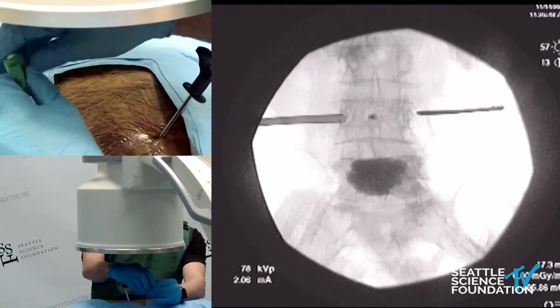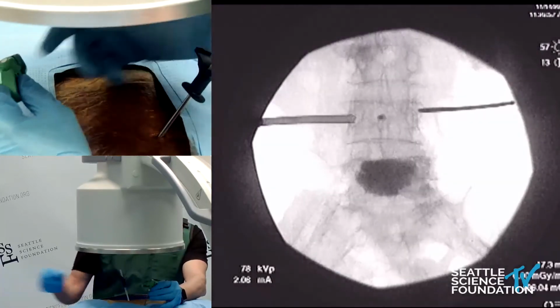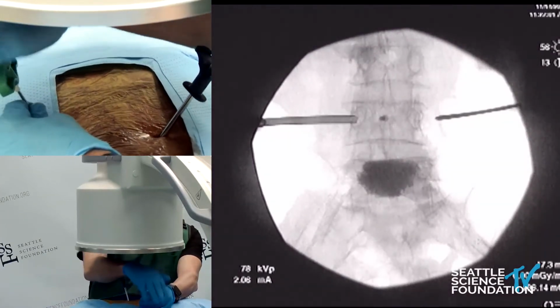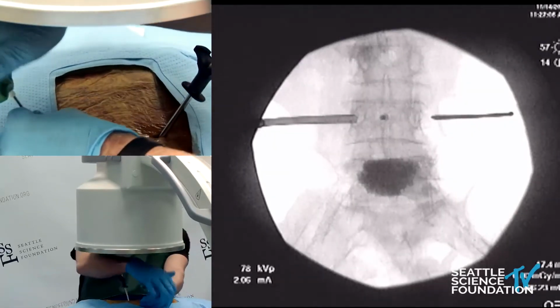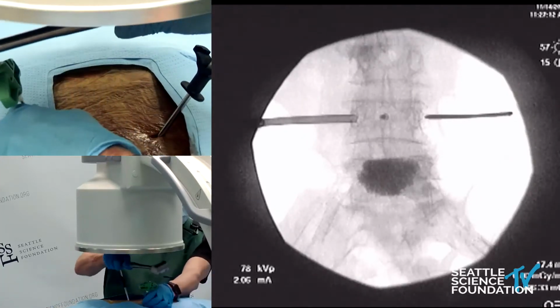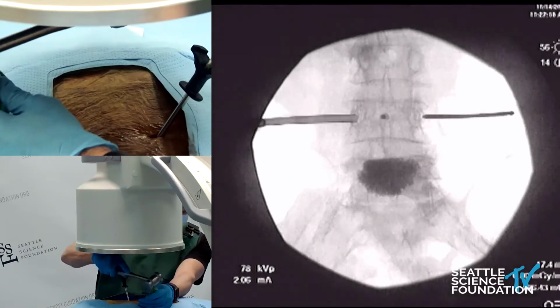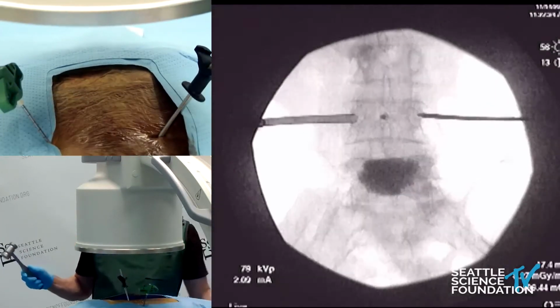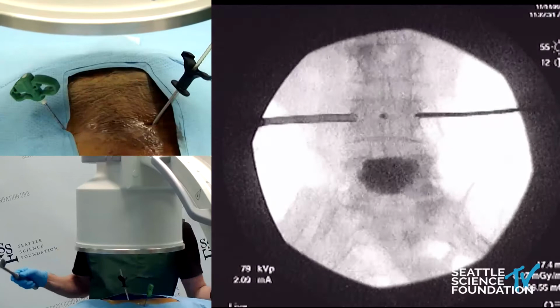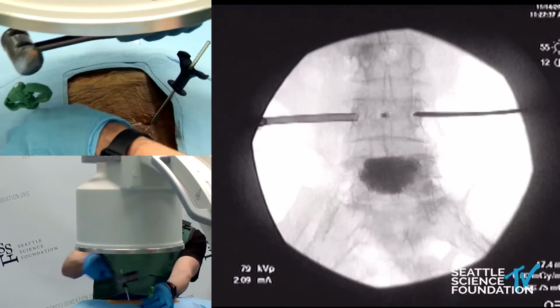Yeah, again, nice flat access. Okay. Good. And we have the other one appropriately angled, so tip and trick is on the outside of the patient. The needles should look symmetric in terms of their angulation. Not only do we look at the fluoroscope, we have to make sure that it looks okay from the outside too, using all your visual spatial tips and tricks to make you the master, to be able to use the force.